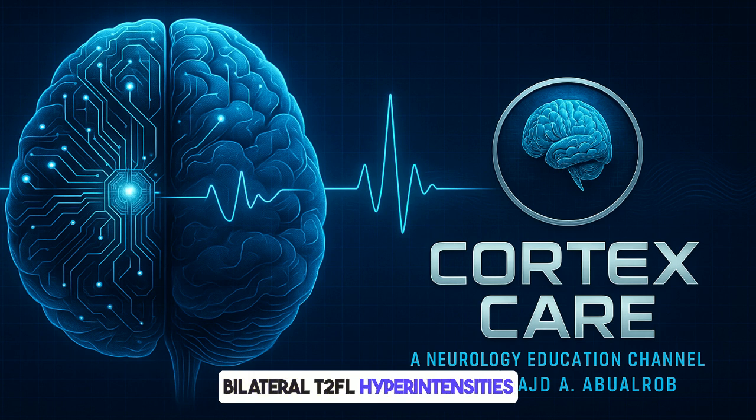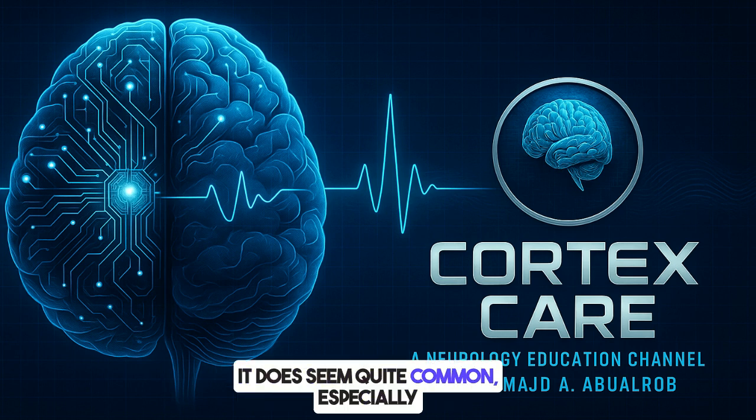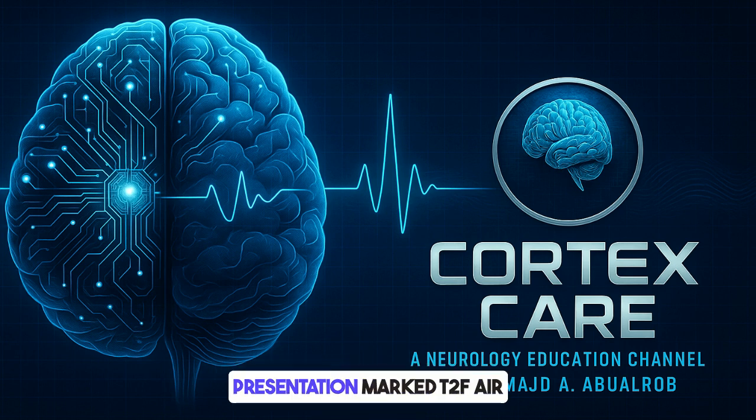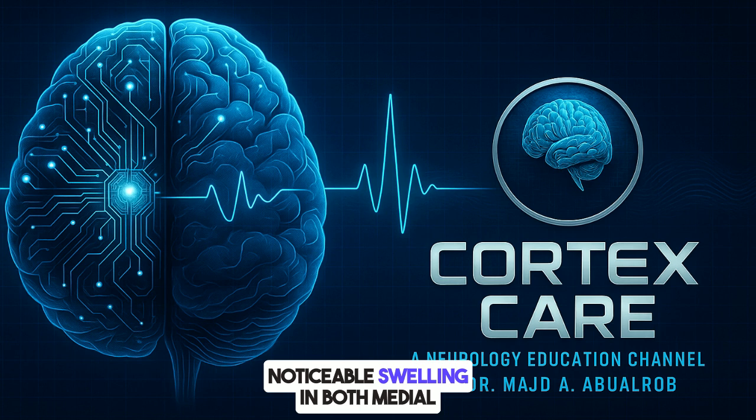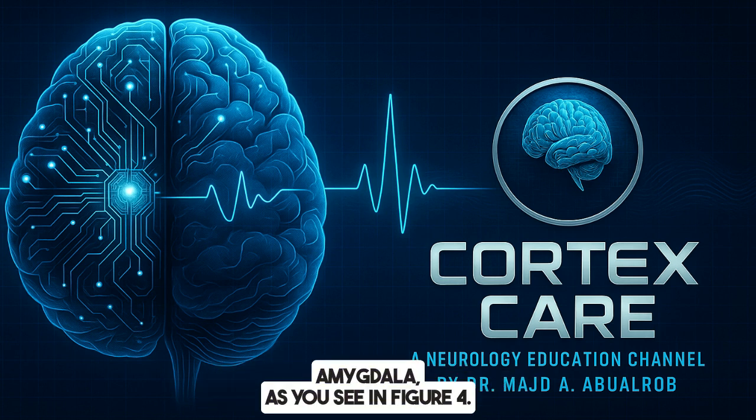Figure 4 shows a case with bilateral T2-FLAIR hyperintensities in the medial temporal lobes. Bilateral, okay. So affecting both sides seems common here. It does seem quite common, especially in the limbic encephalitis presentation. Marked T2-FLAIR hyperintensities, often with noticeable swelling, in both medial temporal lobes, hippocampus, and amygdala, as you see in Figure 4. Right.